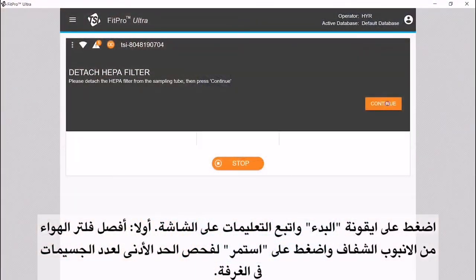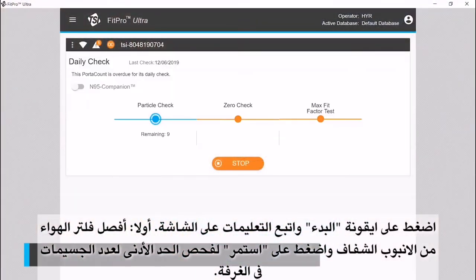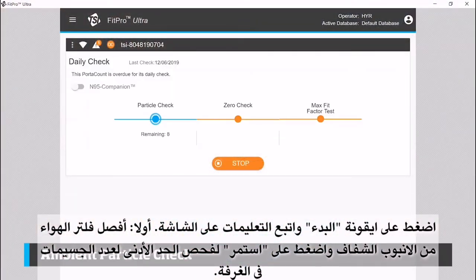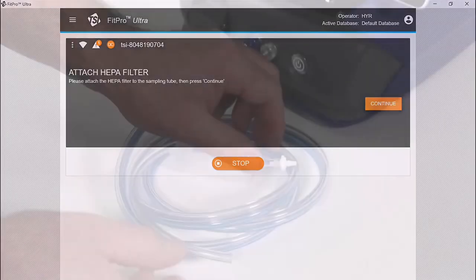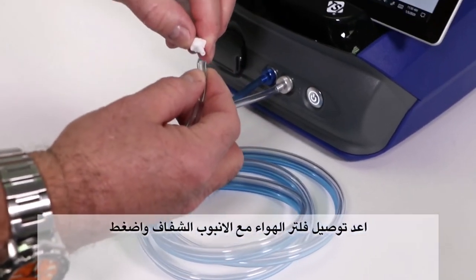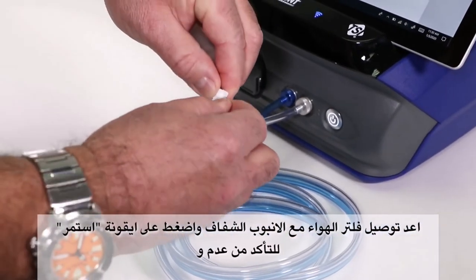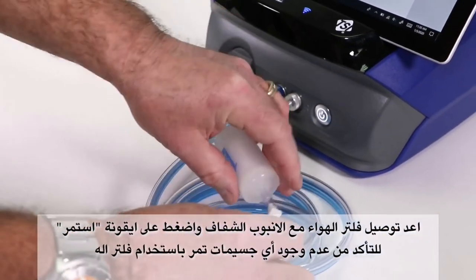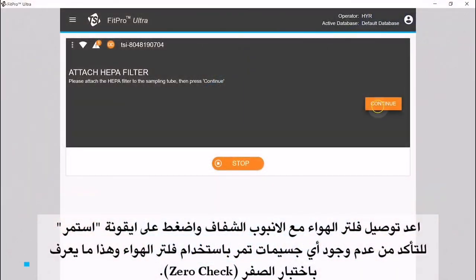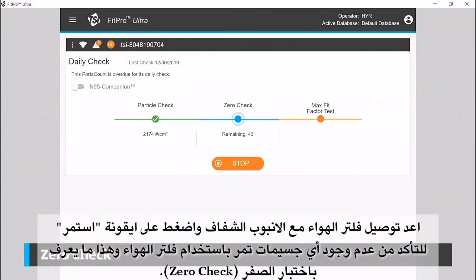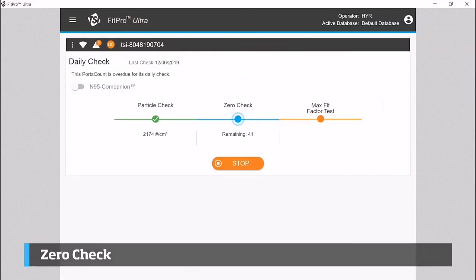First, remove the HEPA filter from the clear sample tube. Press continue to conduct the minimum particle check test. Reinstall the HEPA filter on the clear sample tube when prompted, then press continue to conduct the zero check and the maximum fit factor tests.